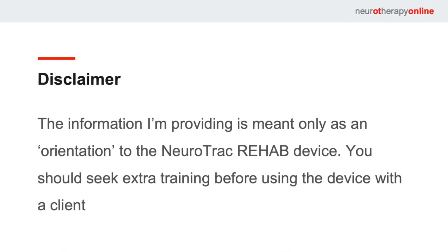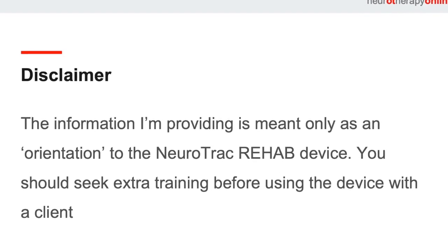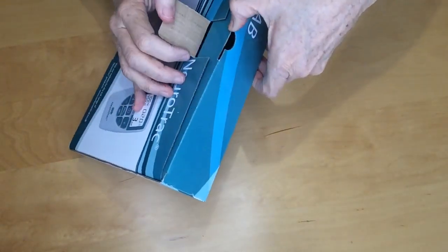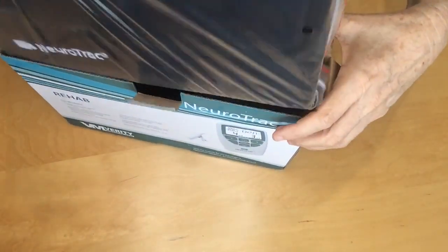Now comes the fun stuff — opening the box. But before I do that, I need to make a disclaimer that the information I'm providing is really for orientation to the Neurotrack Rehab device only. It's not sufficient information for actually applying electrical stimulation to a client without further training.